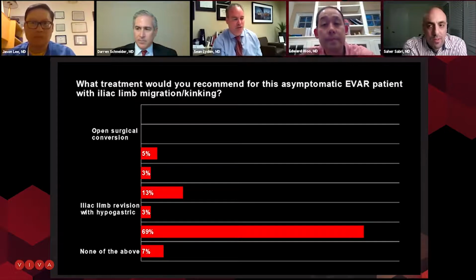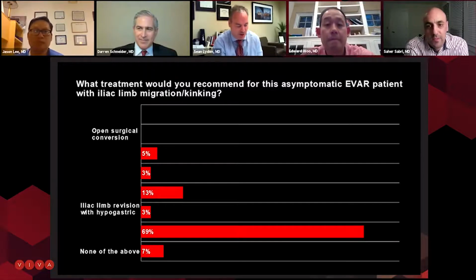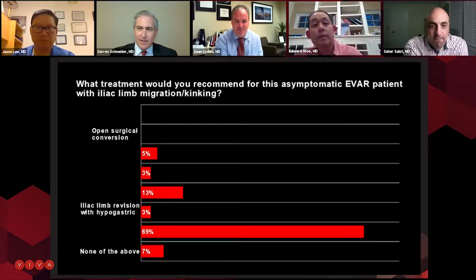So we have a question from the audience: how are you going to get an iliac branch through all that kinked metal? And that was a question I was going to ask: how concerned are the panelists about trying to push something through there? Because the risk is when you bring an iliac branch device, you end up with a limb occlusion. Yeah.